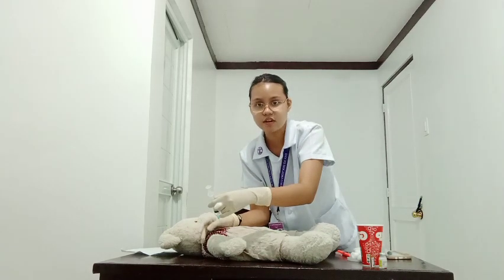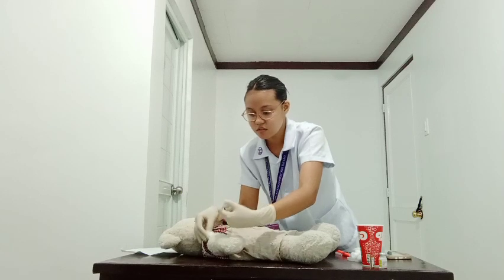Afterwards, apply gentle pressure at the site with a dry sponge, like this. It is not necessary to massage the area at the site of injection, as this minimizes patient discomfort. If bleeding occurs, apply pressure with a dry sterile gauze until it stops. Now we need to activate the needle safety device or discard the uncapped needle and attached syringe into the proper receptacle to prevent an injury.